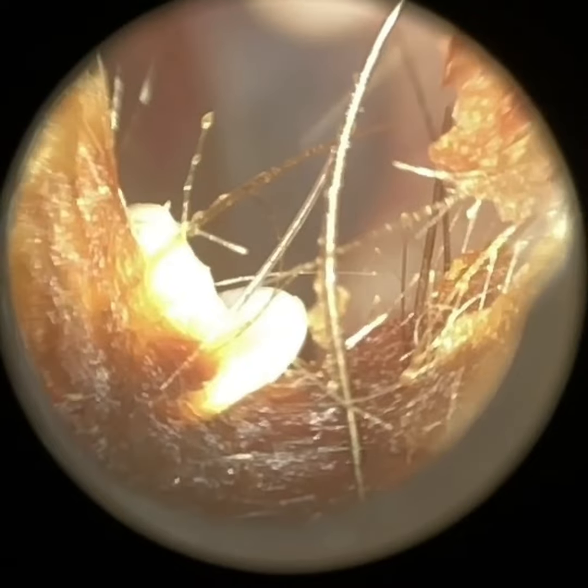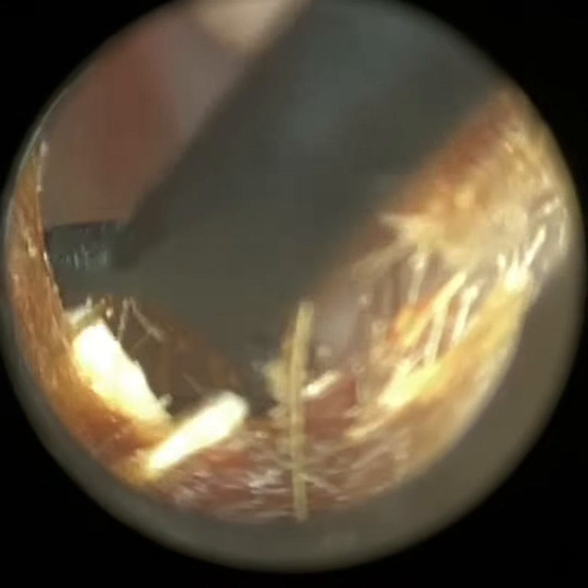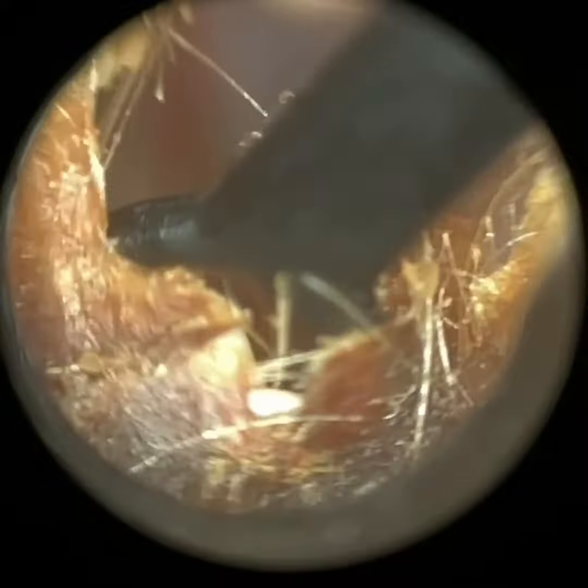Just a very short video for you. The patient attended with a hearing aid wax filter lodged in the floor of his ear canal, surrounded by some really dry crusted wax and skin, so I'm just going to remove that.